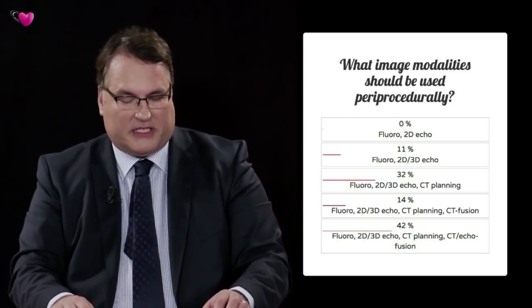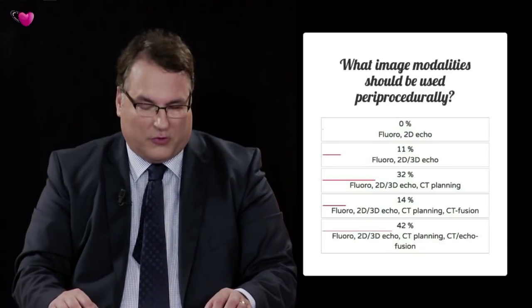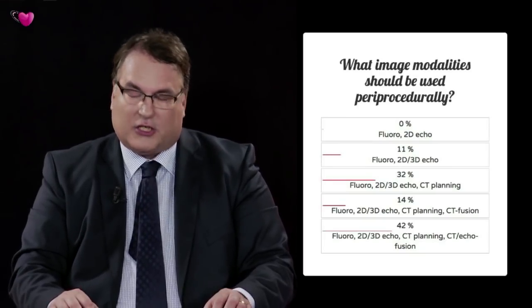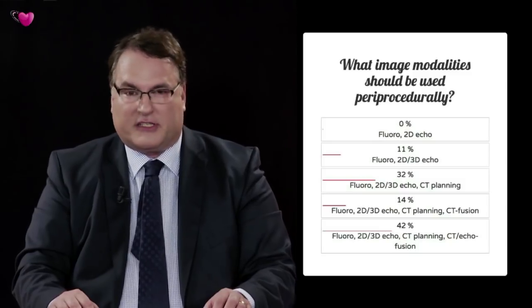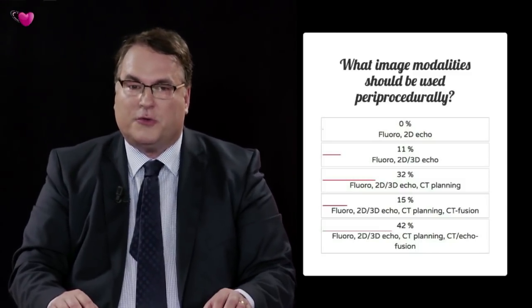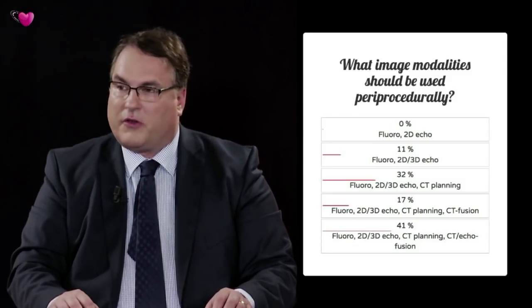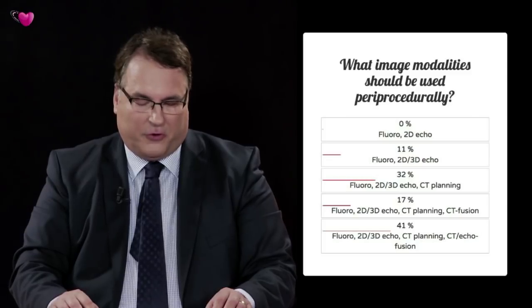The lowest number of participants already wanted to go for fluoroscopy and 2D, 3D echo only. The majority of voters actually had two preferences. One is the current reality, which is fluoro, 2D and 3D echocardiography and CT planning. This vote got 1/3 of all viewers.